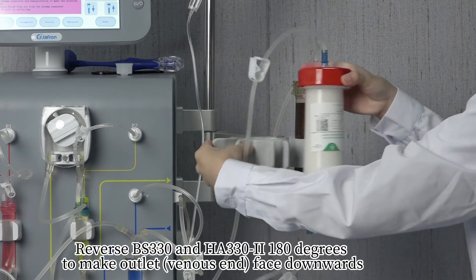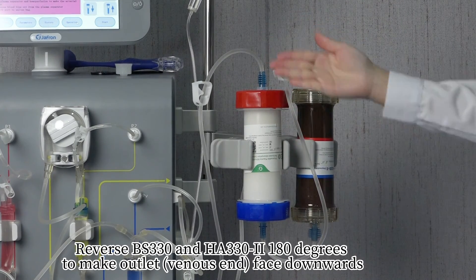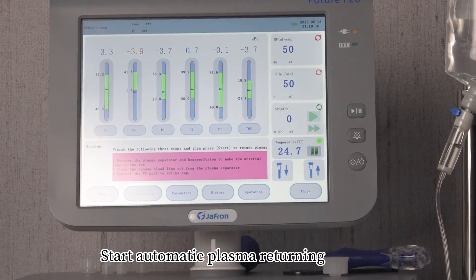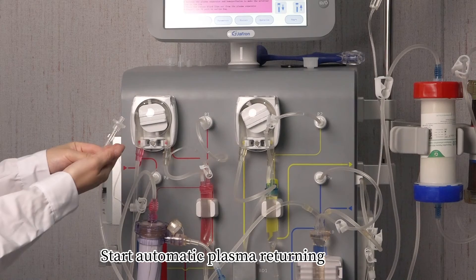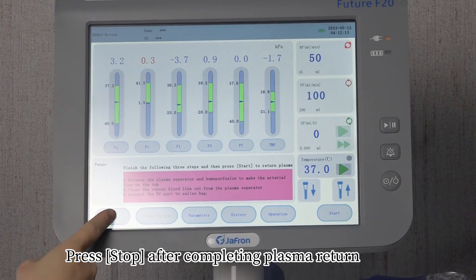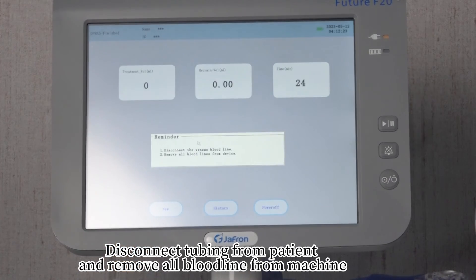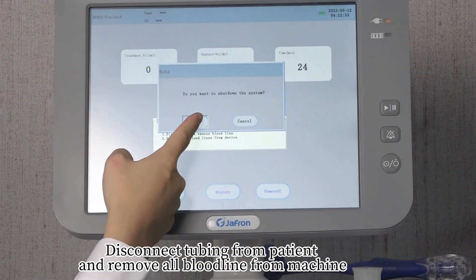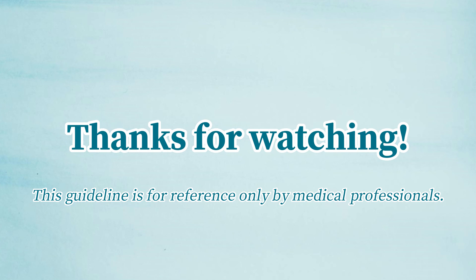Reverse BS-330 and HA-330-2 by 180 degrees to make the venous outlet end face downwards. Start automatic plasma returning. Press 'Stop' after completing plasma return. Disconnect the tubing from the patient and remove all bloodlines from the machine. Note: This disconnection procedure is for reference only by medical professionals.